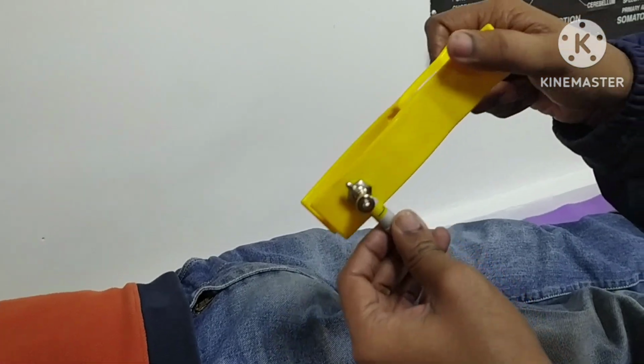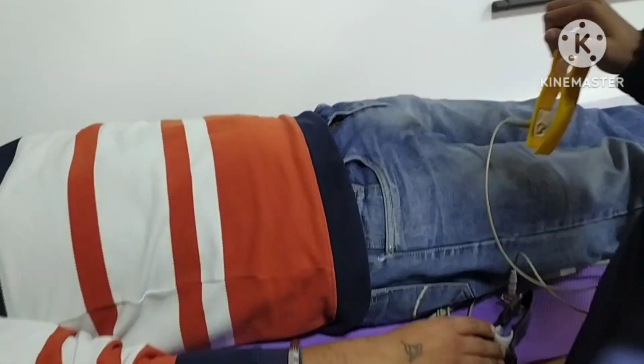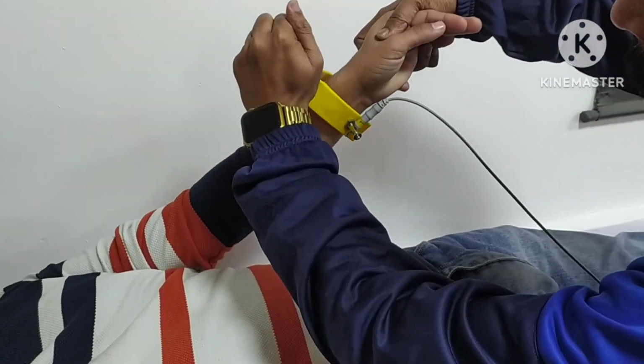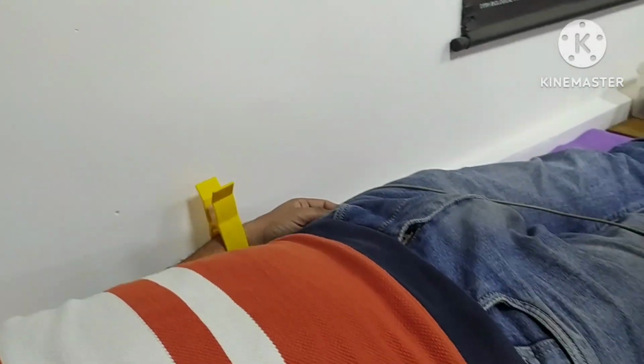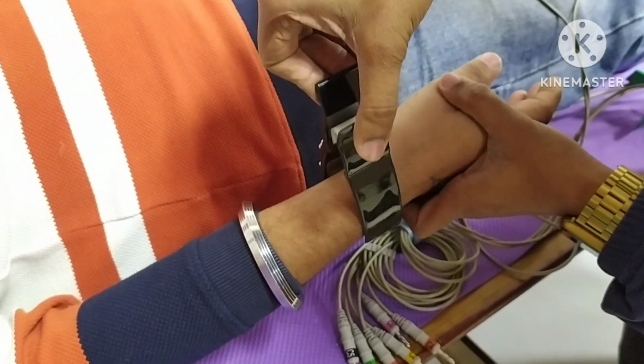So this electrode we can place on the left arm of the subject, on this side like this. And this electrode we can place on the right arm of the subject.